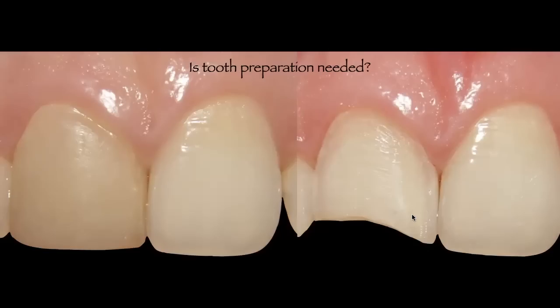because you have to compensate for the thickness of the restorative material. In this particular case, and this is one thing that I wanna be very specific about, the depth of the preparation has to do directly with the underlying color of the tooth structure. This means that if you have a tooth that is darker, the dentin and the enamel is darker than the neighboring teeth, you're going to have to prep more so that the thickness of your restoration is greater, and now you can compensate to hide or mask the darkness of the tooth that you're going to restore.